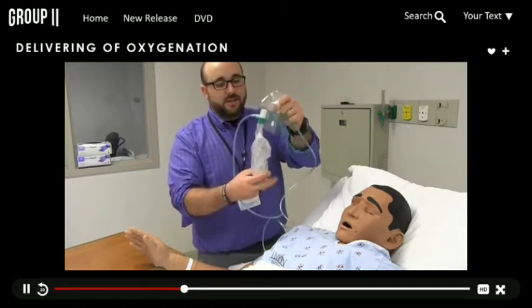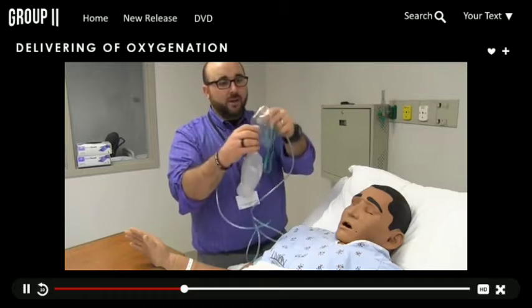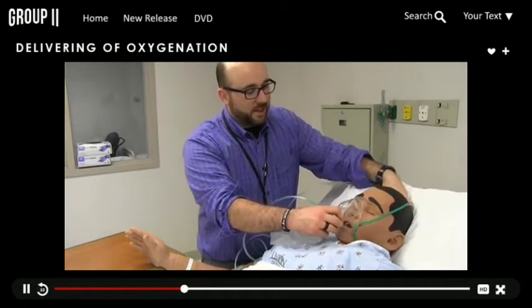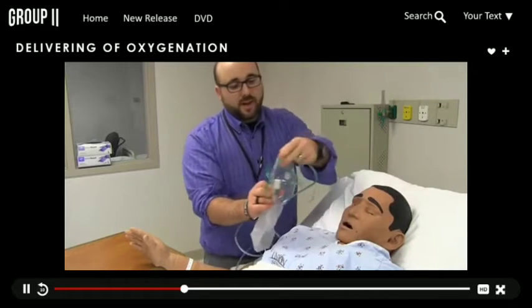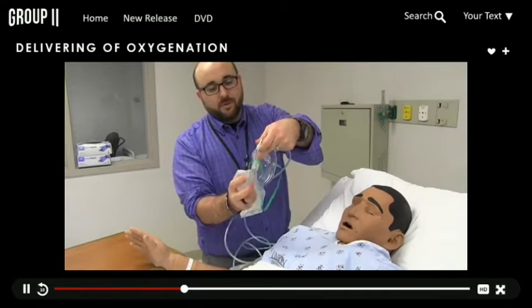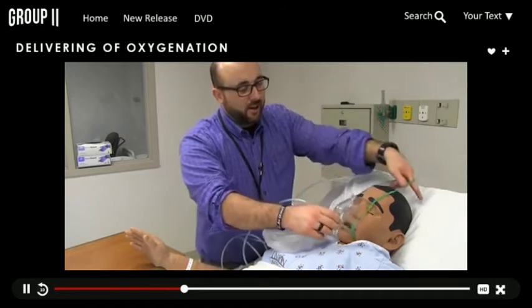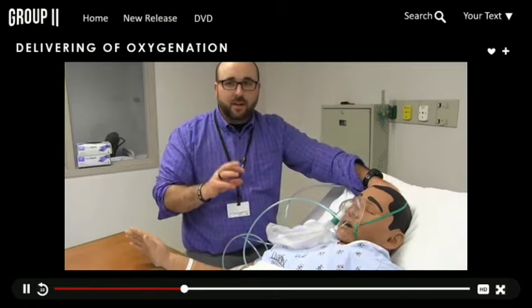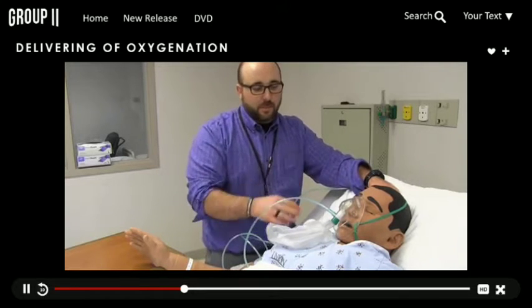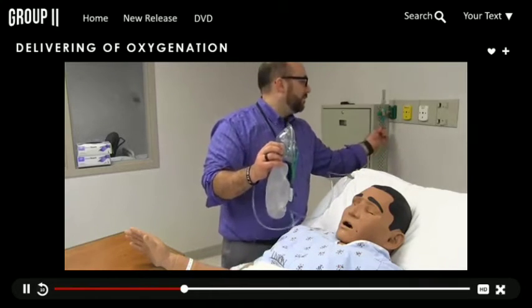So the thing with a non-rebreather, let me unplug it here real quick. It'll come like this. You'll see the little bag hanging off of it. That means it's not ready to go. Don't put this on a patient with the bag deflated, because usually what happens is when they take a breath, there's a one-way valve in here and they're pulling air from, guess what? Nothing that's in the bag. So you'll see the bag deflated on it. One thing you always want to see, if you walk in a room, let's say for a rapid response, and you see someone on a non-rebreather, you should always see this bag inflated. It's an RT's pet peeve.